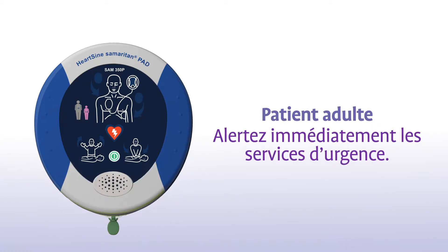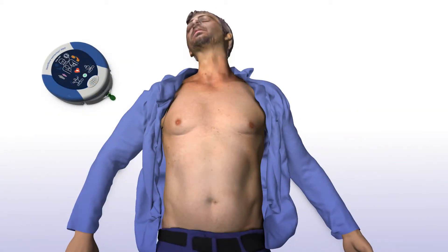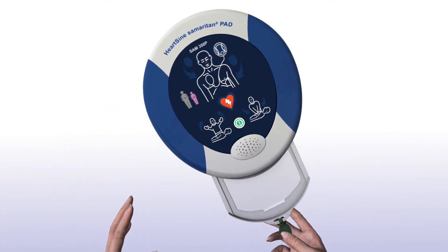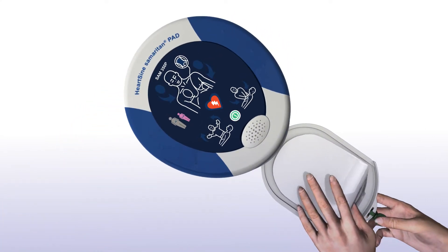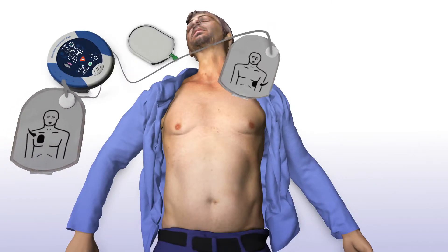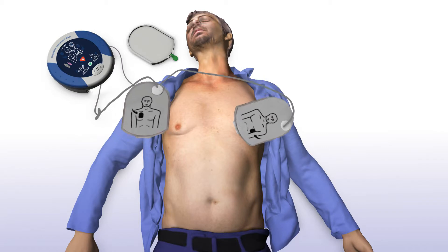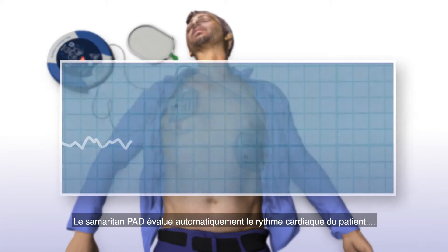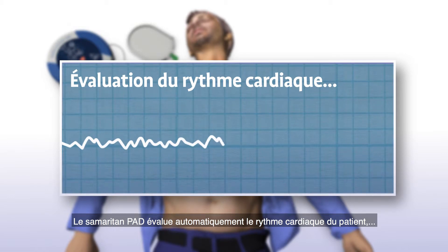Adult patients. Immediately alert emergency services. Remove clothing to bare the victim's chest. Pull the green tab to extract the electrodes. Remove the plastic film from the electrodes. Apply the electrodes to the victim's bare chest as indicated. Press the electrodes firmly onto the patient's bare skin.